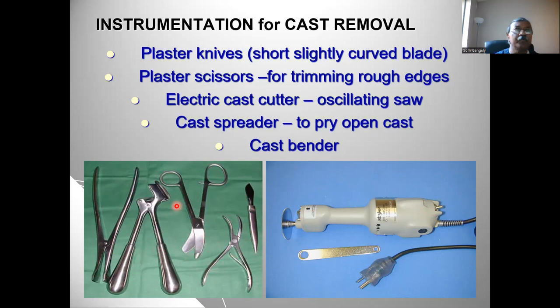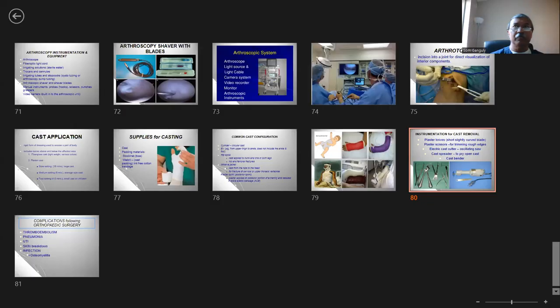So whenever you're doing an orthopedic case, you know you're going to need them at the end of the case, so we get the cast cart in the room. When we are repairing or redoing or removing cast material from a previous surgery, we're going to need this cast cutter and cast spreader and the bandage scissors, because we have to cut the dressing with it. All right, so we need to know where these cast carts are kept. Usually we have an orthopedic storage room where video systems, arthroscopic supplies, implants, fixation devices and cast machines are probably kept.